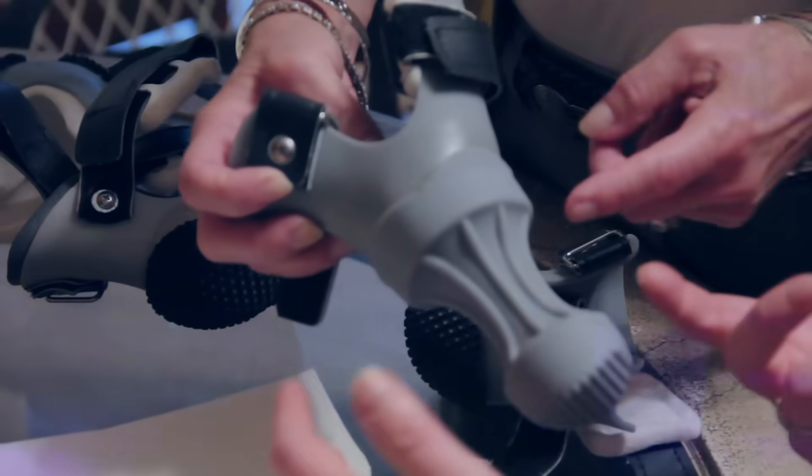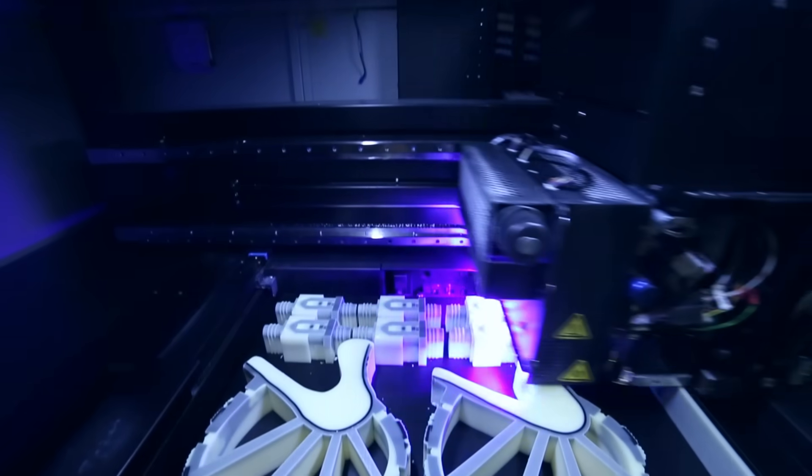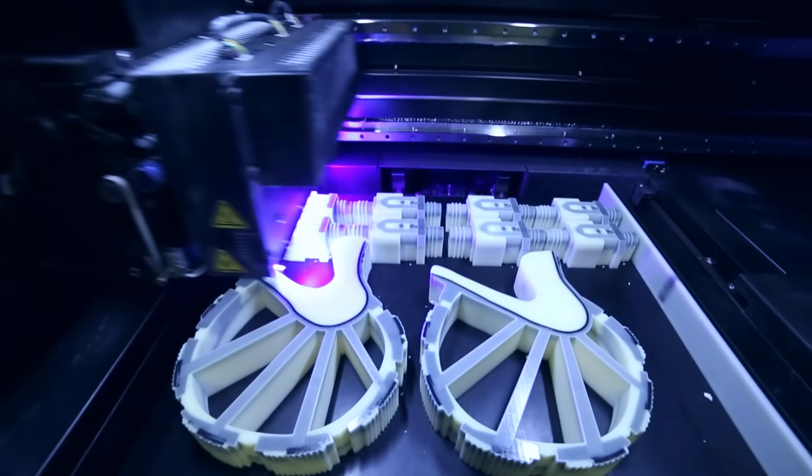With prosthetics in general, a lot of the designs are going to this running man sort of look. I was concerned that with a running man design he would end up digging them into the dirt, and so that's really where I came up with the loop idea.